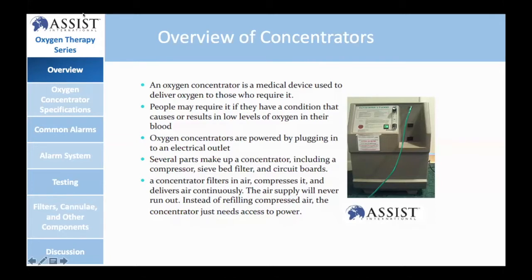I will give you an overview of the oxygen concentrator, including the working principle. And then I will pass it back to Benjin to walk you through the most important alarms that you need to be aware of as a clinician or as a user.